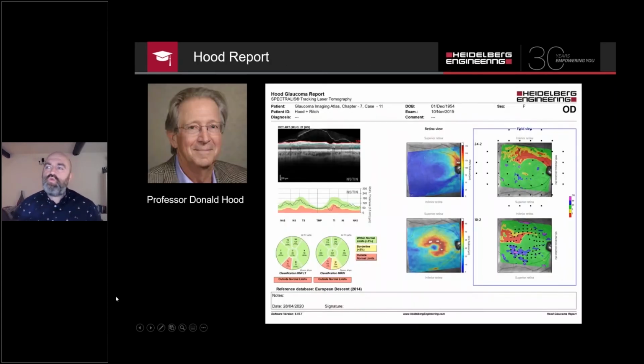So we now have a new report available, and this is sometimes known as a controversial report. But if you do Google and YouTube Donald Hood, he's got some really great lectures out there. And Donald Hood is a professor who's based in the US, who spent many years now comparing OCT thickness information to the visual field results. And this has resulted in the Hood report, which we can produce, as well as a few other manufacturers now, I believe.